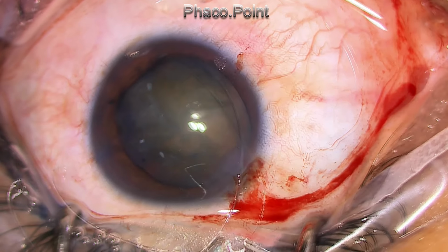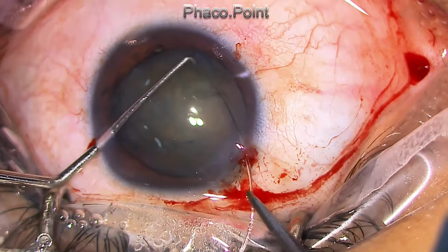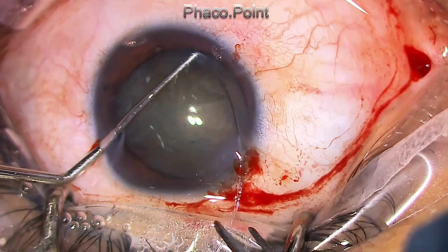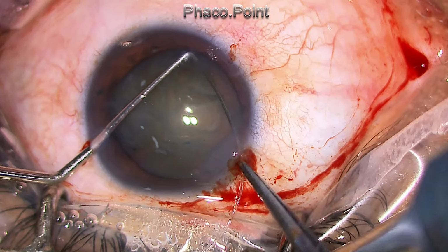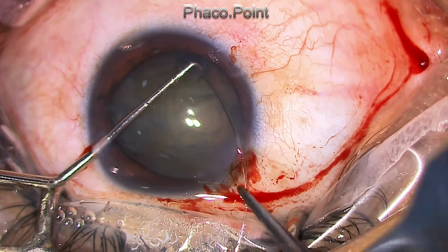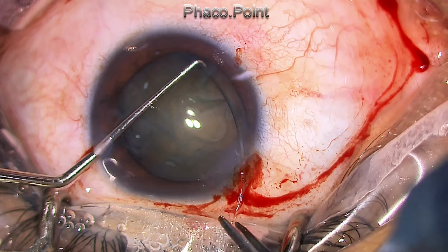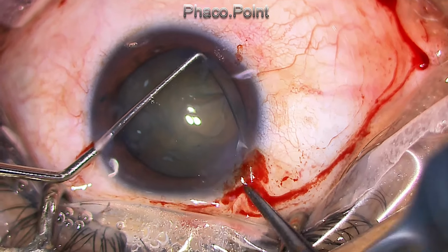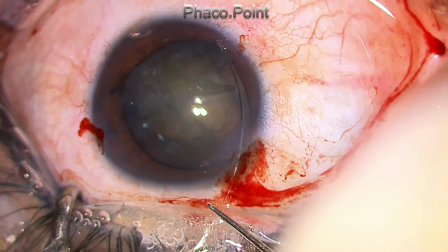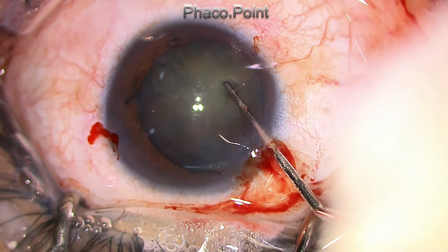It is highly possible if you're doing a controlled and structured manual insertion of the CTR at the beginning of the procedure itself. You just have to get the right plane and push the CTR to the periphery. You have to create the mechanical space and separation, and then put in a little viscoelastic between the anterior capsule and the cortex. So once the CTR was in position, I was more confident with this case.